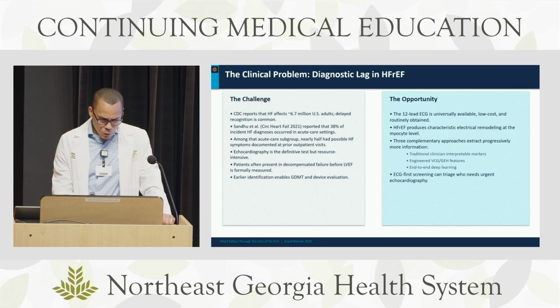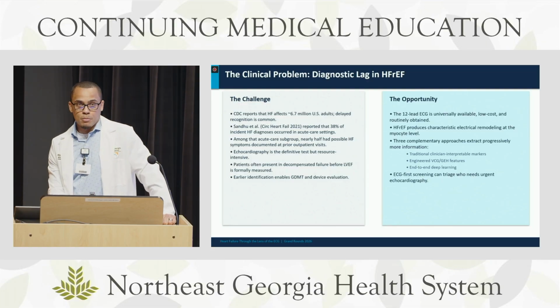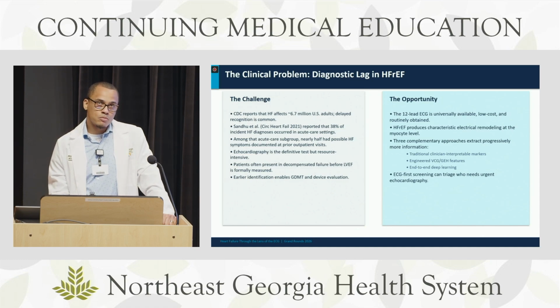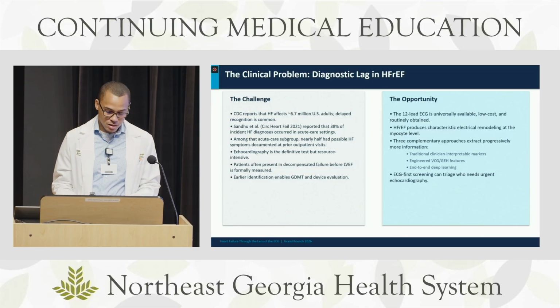One of the things I will be discussing is how the traditional markers that we find in EKGs fare and correlate in helping us identify systolic dysfunction. I also looked into which other information can be extracted from EKGs and how that information can be used for the diagnosis of heart failure. And lastly, I will integrate all of that information and use AI to see if we can identify systolic dysfunction.